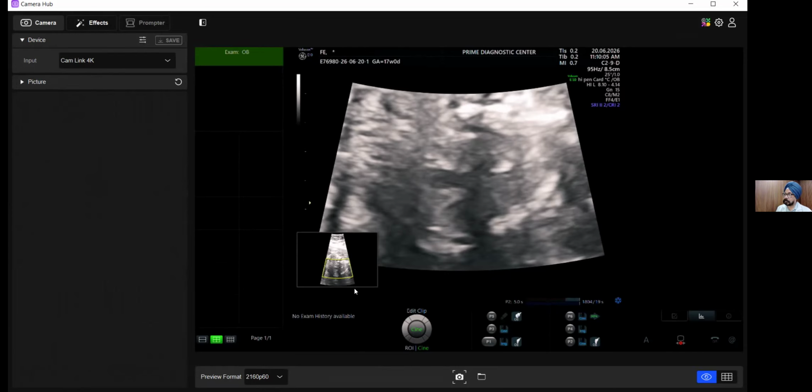So if there are no questions, I think we move forward for the next patient. We just scan few patients, normal, abnormal. Yeah, get the next patient. And then maybe if time permits, we would do small short talks. Otherwise, if we continue to scan patients, we'll not be able to finish our theory part, which I think is important because we've reasonably scanned a good number of patients by now.